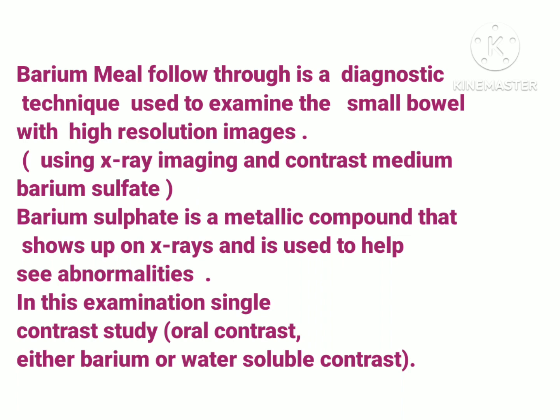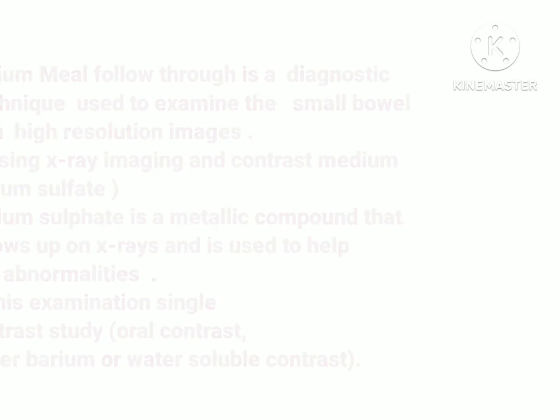So we can either give barium or we can give water soluble contrast, because if we are concerned about a small bowel leak, that time we can use water soluble contrast given orally to the patient.